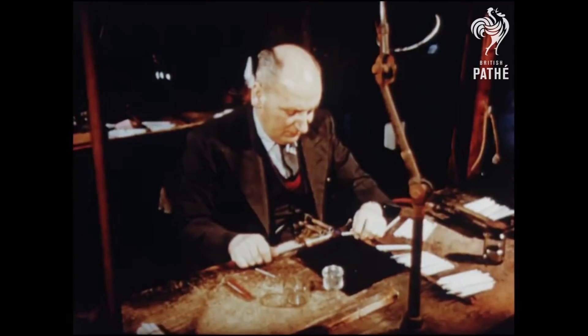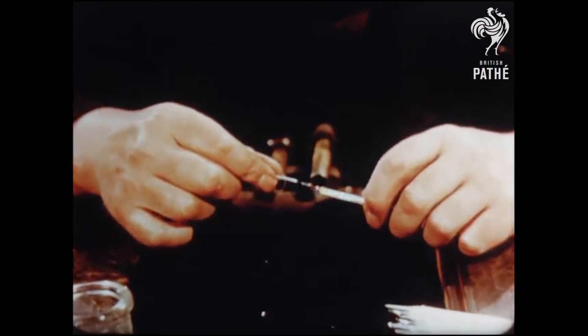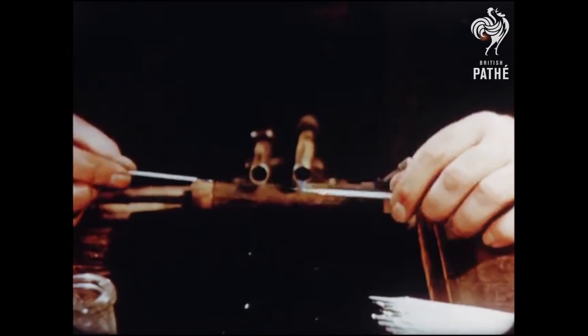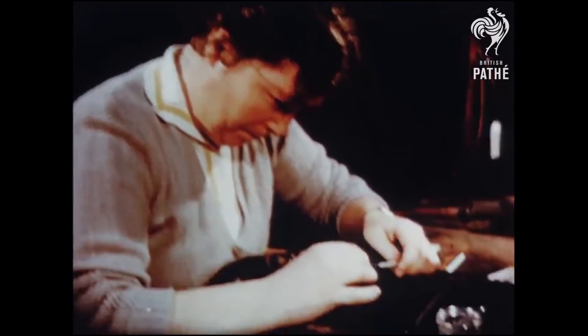Now the bulbs of the thermometers are formed by joining short lengths of special glass tubing onto the stems. The tubing is joined to a small bubble at one end of the stem, and then sealed off to the correct length — a job which calls for deft manipulation by the women workers.